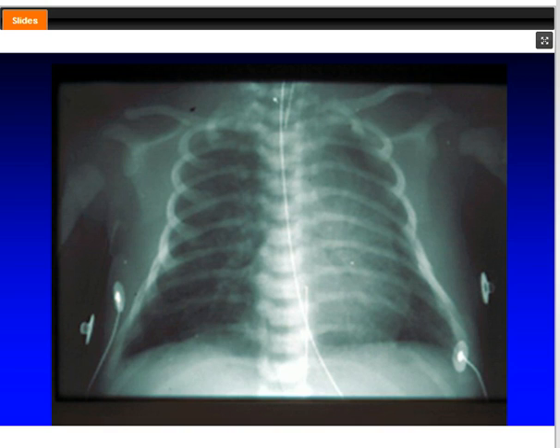So they put the baby on 15 hertz, and the baby winds up air trapping, and they wonder, why is the baby air trapping? They turn the mean airway pressure down. It doesn't help. The baby remains air trapped. They say, get rid of the damn ventilator and put the baby on another one. Well, the answer is, it's not the ventilator's fault. It's the driver of the ventilator's fault, because you are air trapping this baby by being on too fast a frequency. Remember, term infants never more than 10 hertz, and typically 8 hertz would be a better number for them.